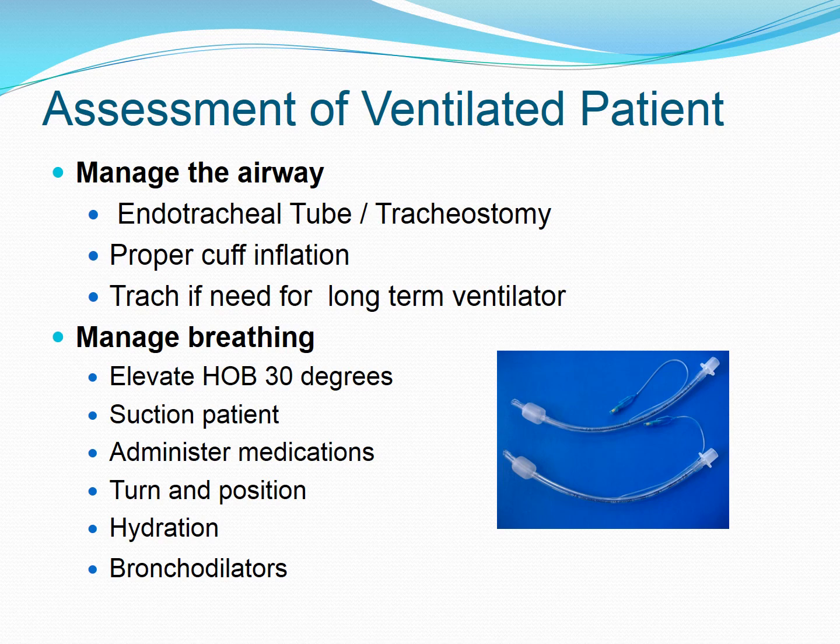Don't suction the patient just to suction the patient, because you only need to suction them when they have a lot of secretions. Many times before you suction, you want to make sure that you hyperoxygenate the patient. There is a button on the ventilator that says hyperoxygenate, and then you want to suction your patient. Now, when you're suctioning your patient with the Ballard suction, when you start pushing that suction catheter in, the minute that patient starts to cough, pull it out.